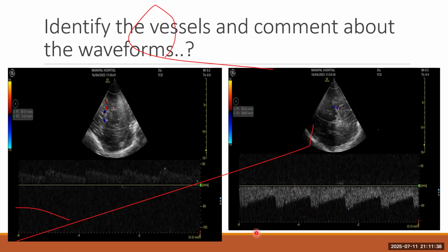One thing is there is a stenosis between the P1 and P2. As per the Spencer-Reid curve, it is somewhere between 60 to 80 percent. That could be one differential diagnosis. Or the other, physiological diagnosis, could be? Collaterals. Yeah, what collaterals? This is a fetal PCA, okay?